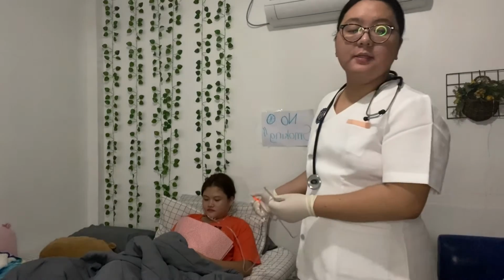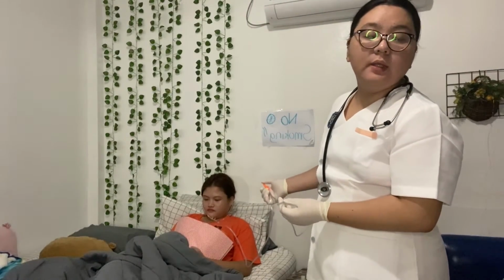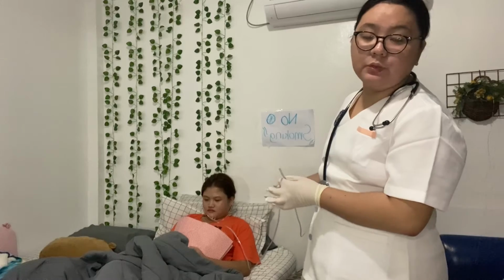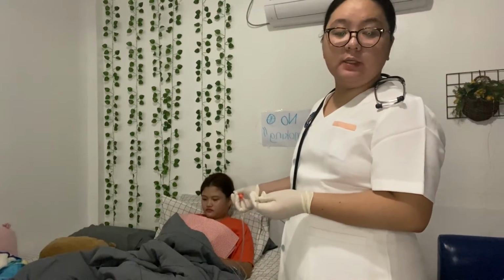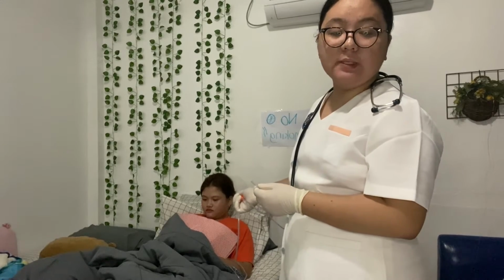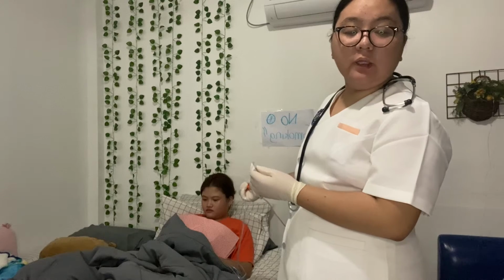And then, of course, after that, without applying suction, gently but quickly insert the catheter with thumb and forefinger into nares using slightly downward slant or through mouth. When client breathes in, do not force through nares. So, the next one, insert the catheter until the resistance is met, then pull it back 1 cm, and then apply the intermittent suction by placing and releasing your non-dominant hand thumb over the catheter.